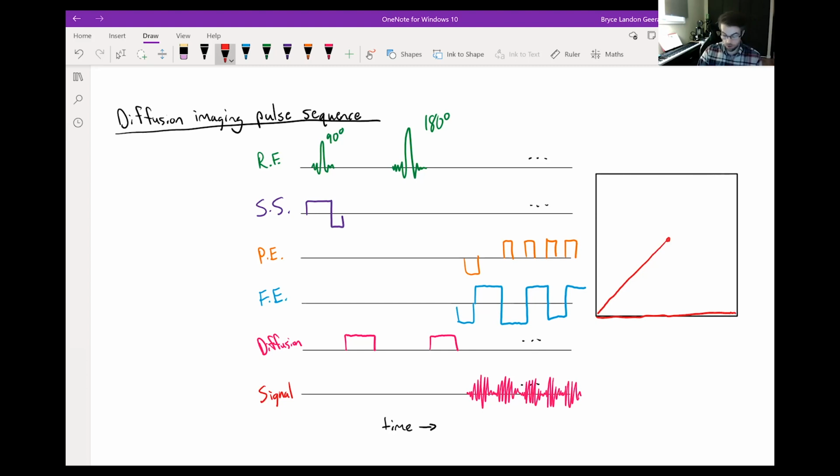Then we're going to pop up in K-space thanks to that phase encoding positive lobe, the gradient there. And we're going to move all the way back across K-space thanks to our negative frequency encoding gradient, and so on and so forth, right? We're kind of snaking across K-space and acquiring our echoes like this. And that, of course, would continue to the top of K-space, right?